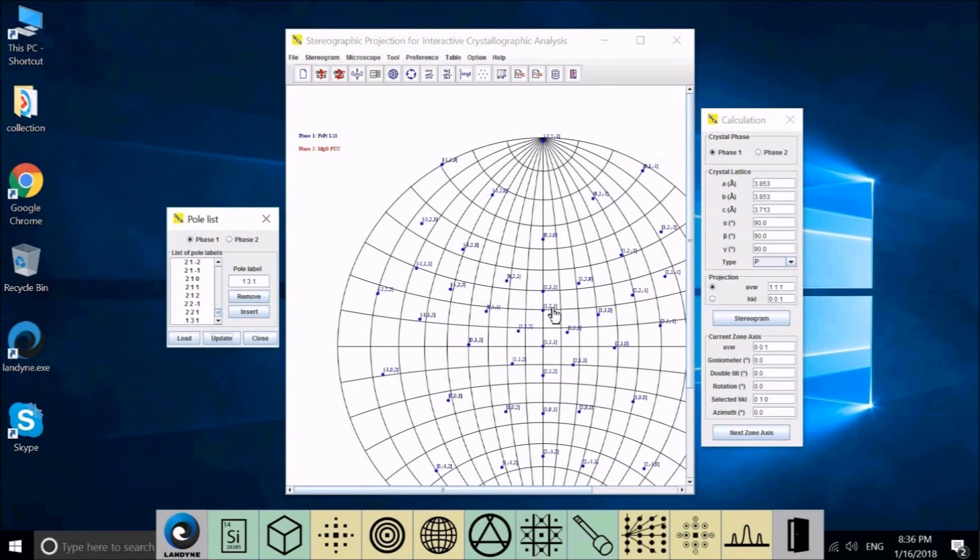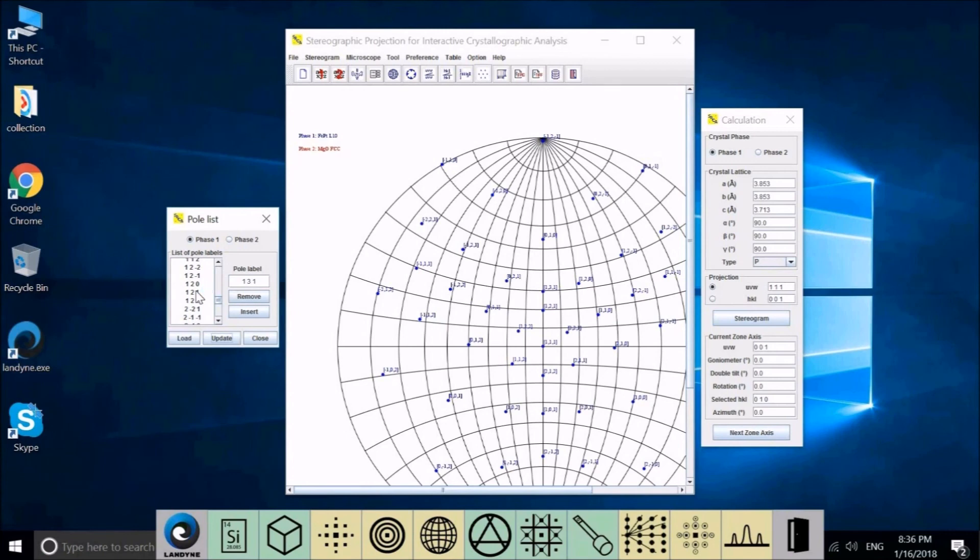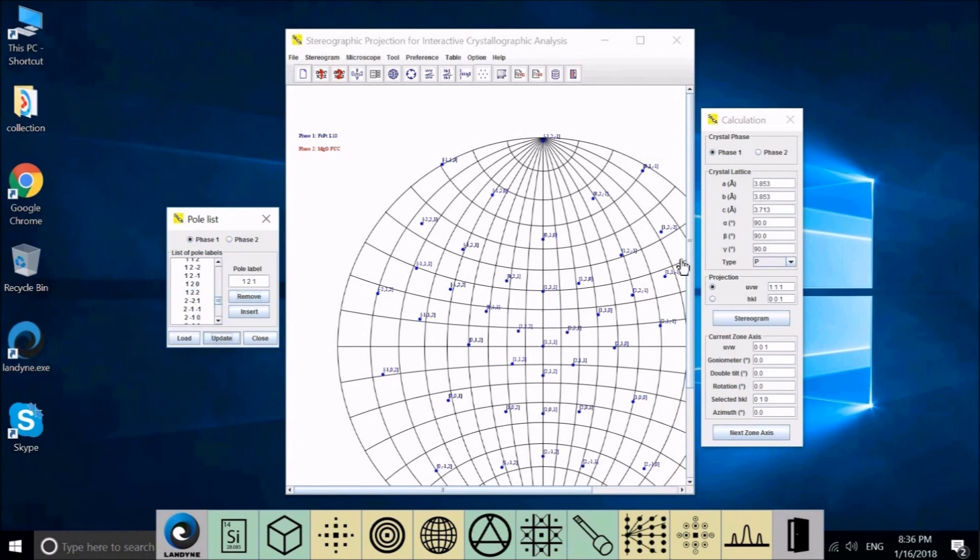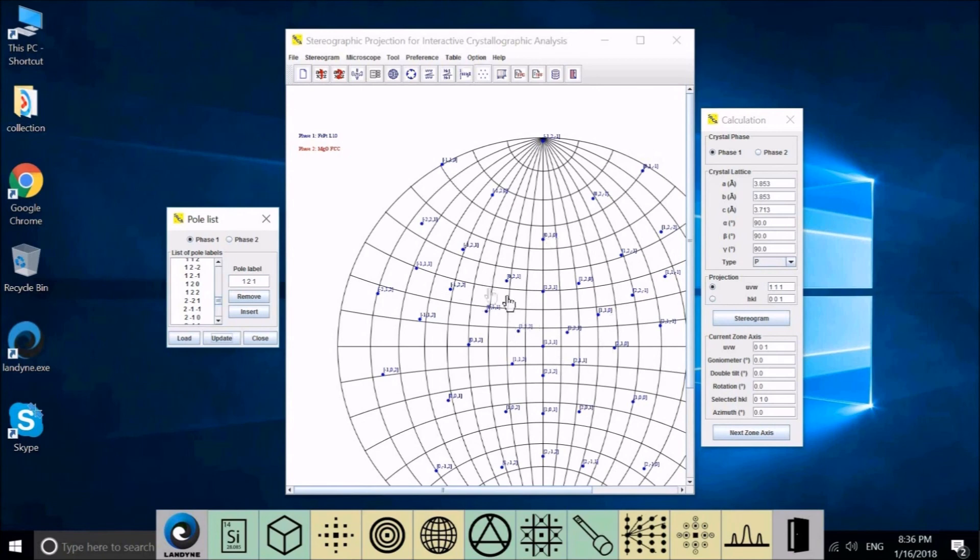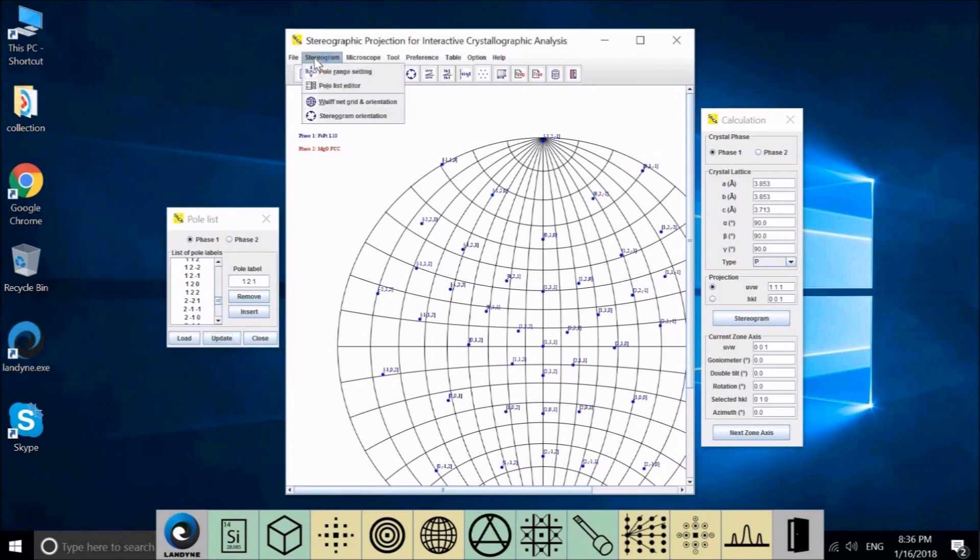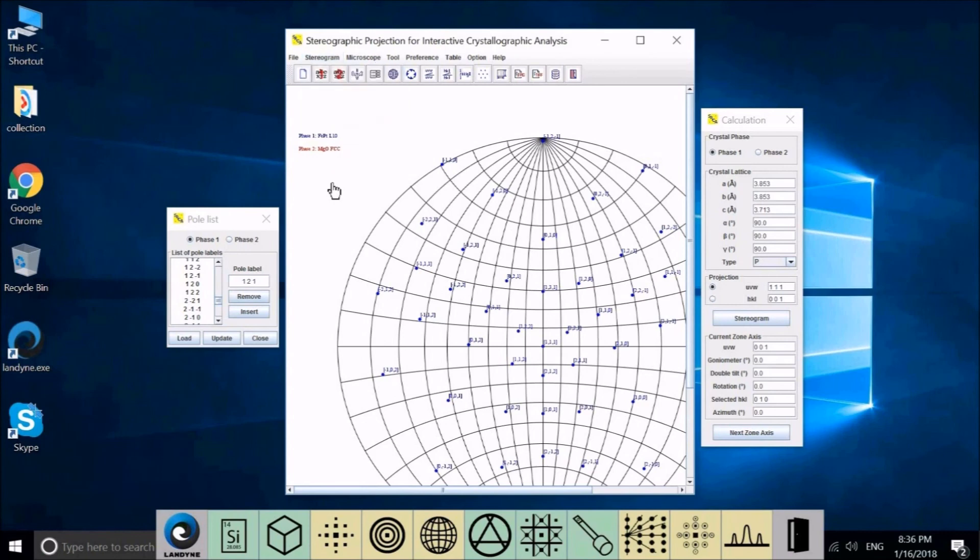And you can check the list here. If we want to remove 1, 2, 1, you can choose 1, 2, 1 here, select it, remove, update. The 1, 2, 1 pole disappeared. By this way, if you combine with the pole range setting and editor, you can have any pole appear in your stereogram.